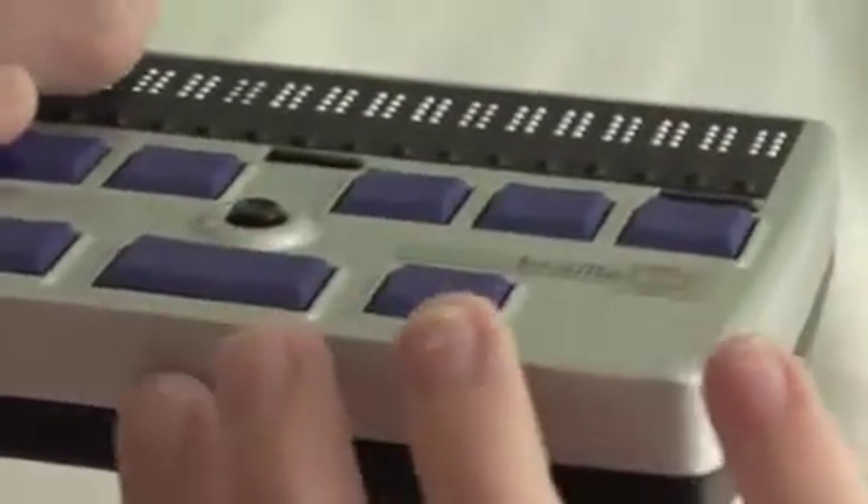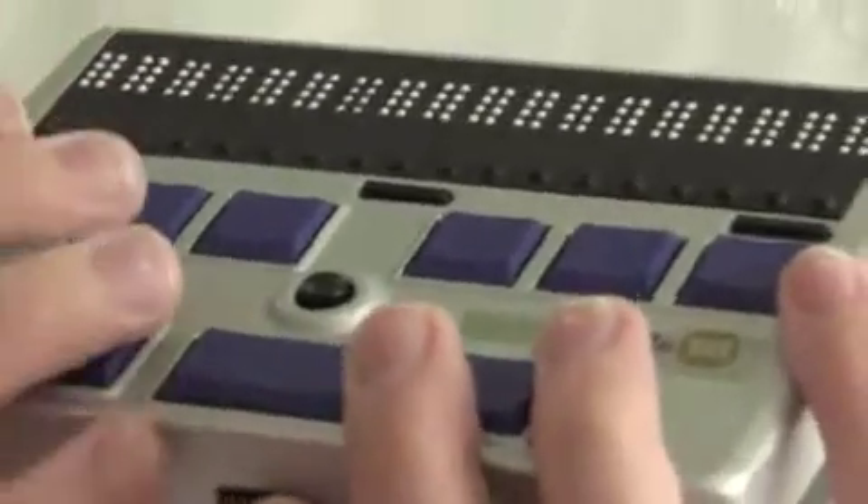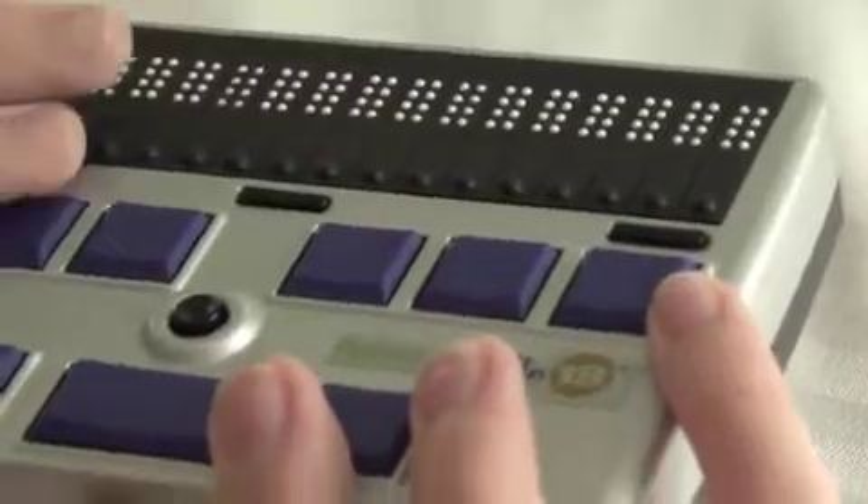On the side of the Refresher Braille 18 facing you, you see an oval-shaped button with an indentation in the middle — it's about an inch wide. If you hold this button when the unit is off it'll turn on, and when you hold this button when the unit is on it'll turn off.